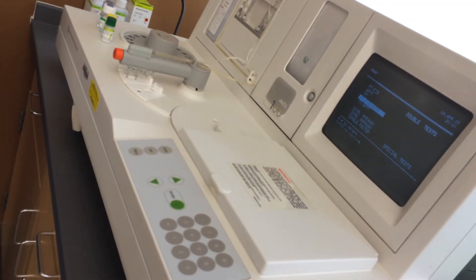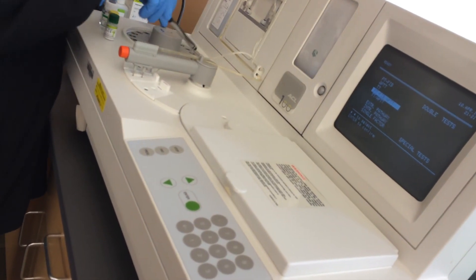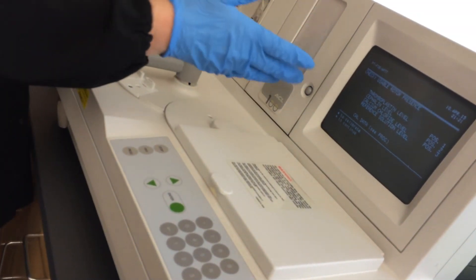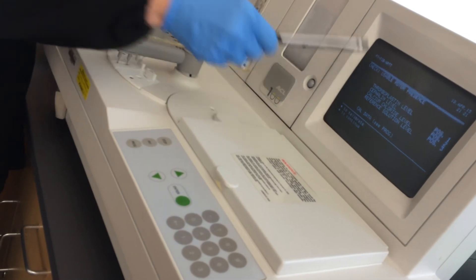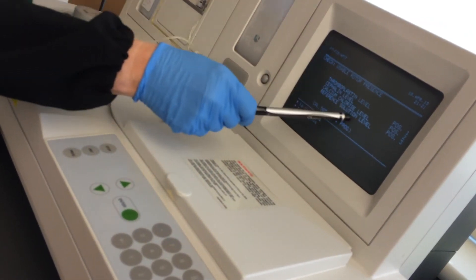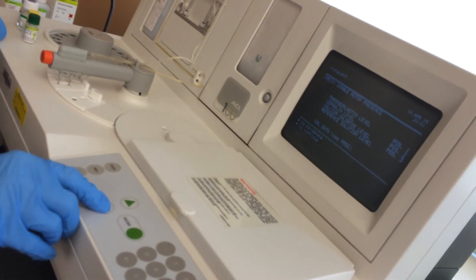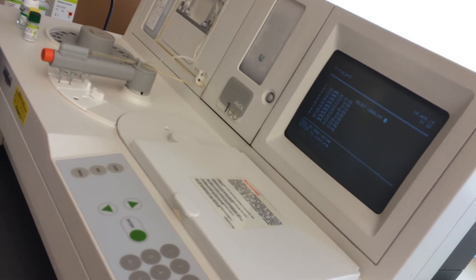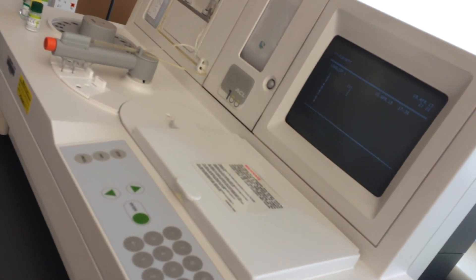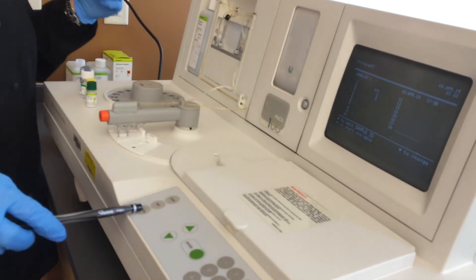I'm going to select this test mode so the machine runs both the PT and the PTT off of these five samples during this run. Press enter. Then it reminds you what you need to have loaded: your thromboplastin, your cephalin which is your PTT reagent, your calcium chloride, and your reference solution. We still have about half a bottle so we're good. Now it says press down to continue, and then we're going to select load list number one. Enter.